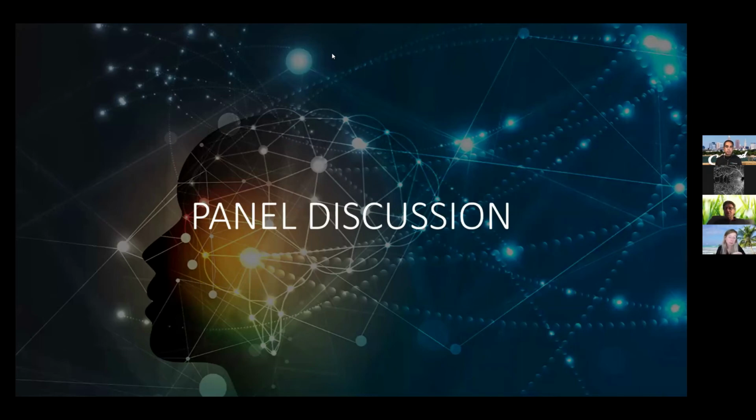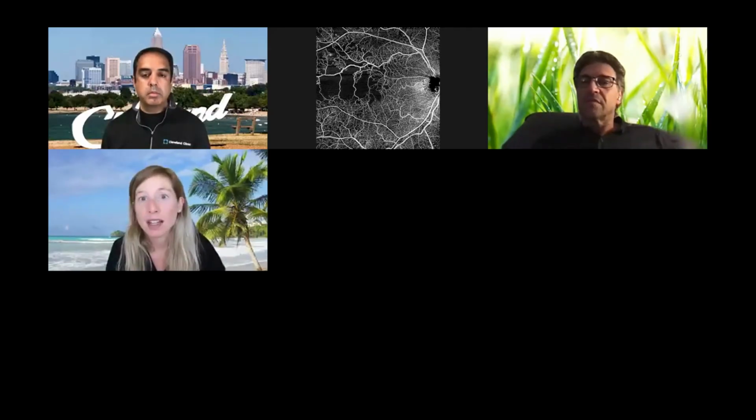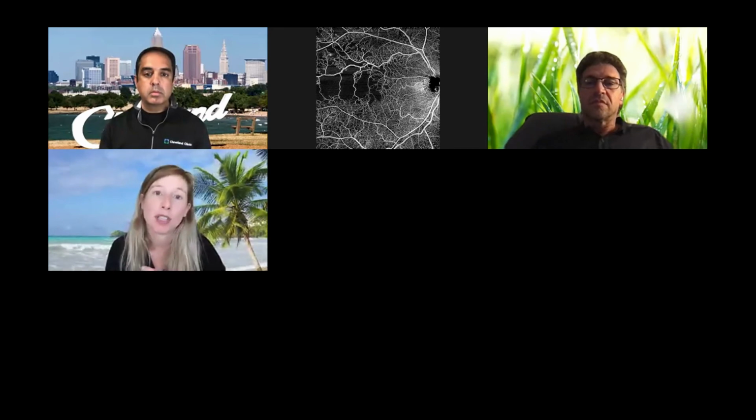Usually what I'll do is I will trace the lesion, usually on ICG, occasionally on FA, depending on exactly what the pathology is. Then I take the largest diameter. I add about 300 micrometers as opposed to the full disc diameter, so a little bit smaller addition. If it's a foveal lesion, I do half fluence PDT, and then peripheral, I'll do full fluence.